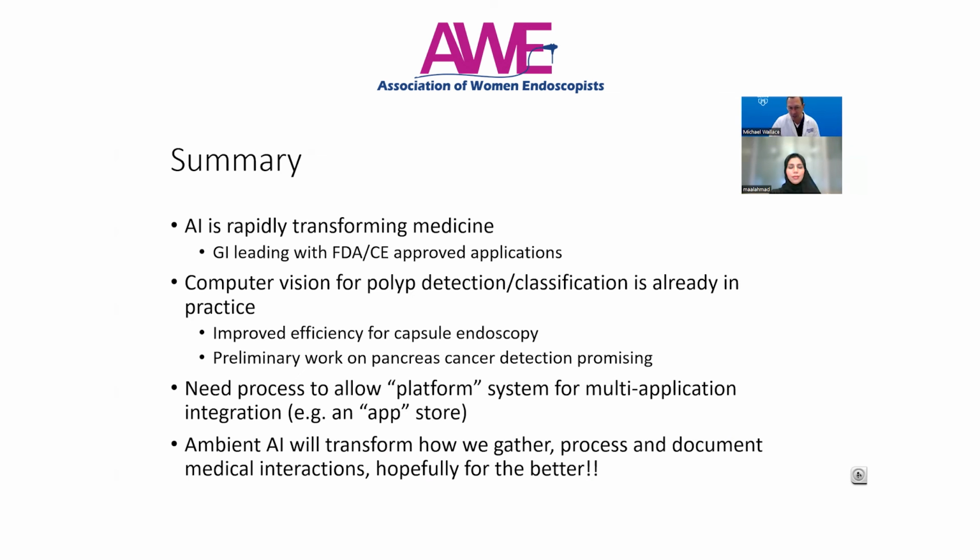And we're very quickly moving towards so-called platform-based systems to allow for multiple application integration, such as an app store. And we didn't talk today about ambient AI, but ambient AI are systems, for example, that listen to an interview between a patient and a doctor and transform that into a clinical note, perhaps some orders, a billing code, et cetera. These really will transform how we gather, process, and document medical interactions, hopefully reducing some of the burden of work and hopefully for the better. But I think we as physicians and other care providers continue to need to guide that process to ensure that these systems really are used for the better and not for the worse.